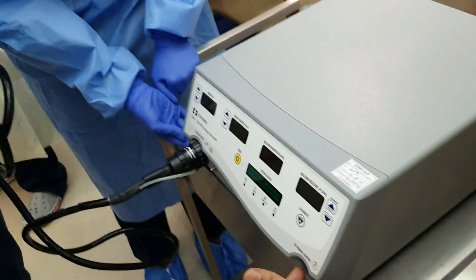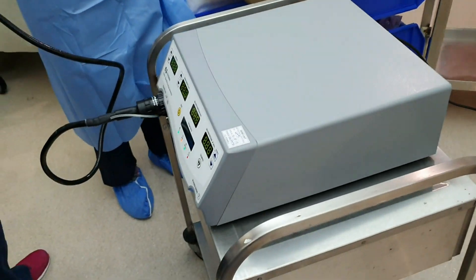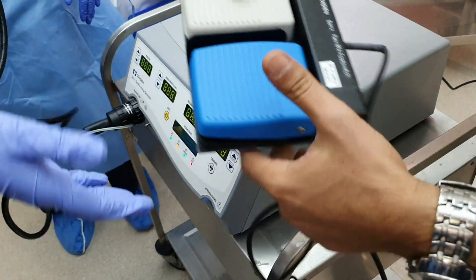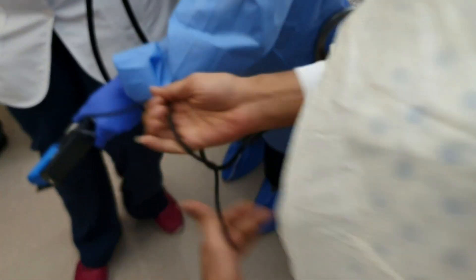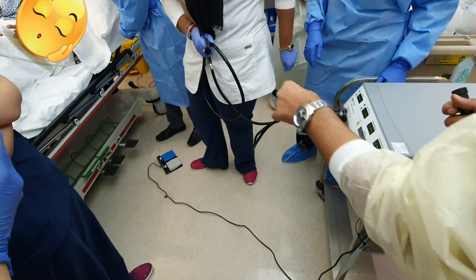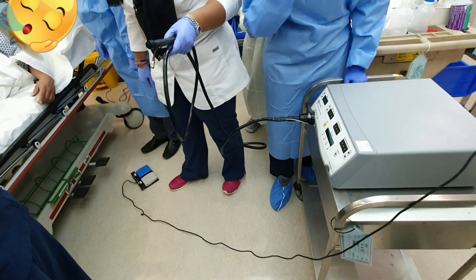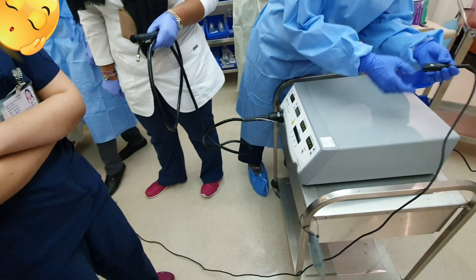This is for the ablation. This is for the switch. The blue one for the ablation, the white one for the other person. This also connects from the back — from the back.